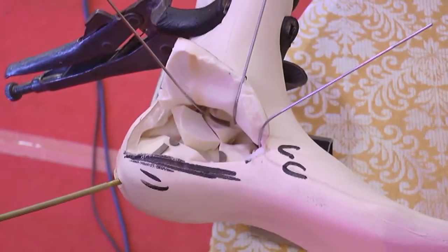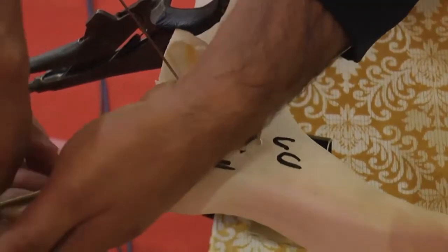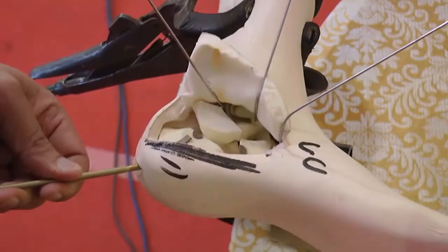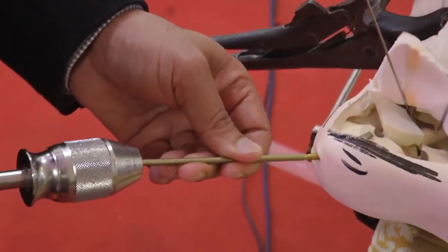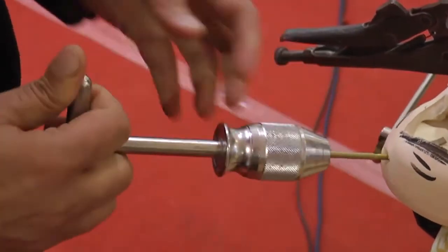Can we remove it? So you have not still entered the sustentacular fragment. So you have reached up to the fracture where in the axial view now you are seeing that the Steinman pin is about to reach the sustentacular fragment.